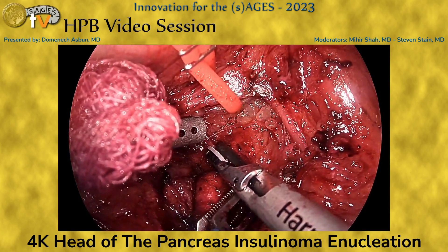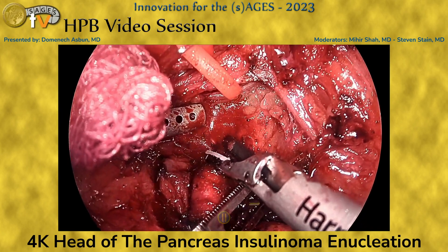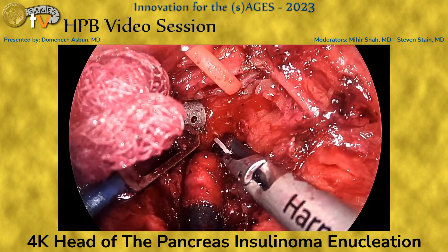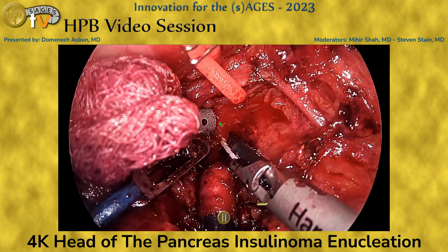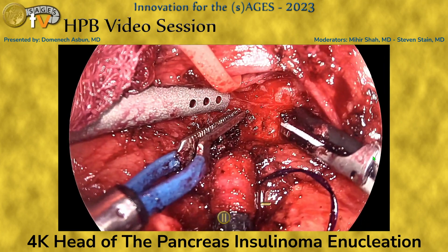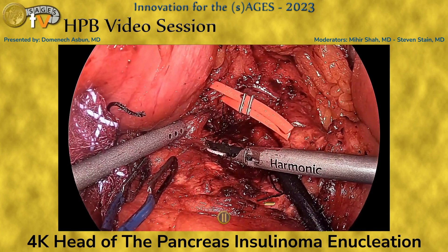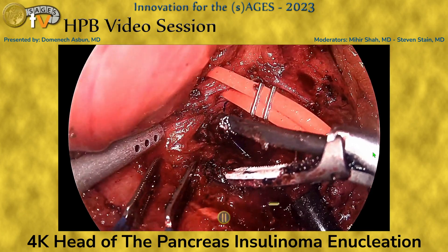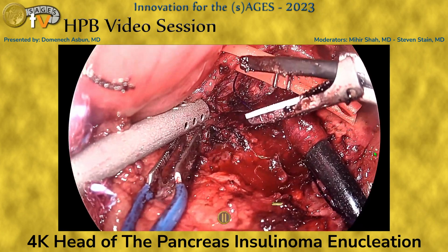We continue with millimetric bites. It's not a large tumor, but it takes a lot of patience to slowly dissect around the lesion for proper enucleation. I want you to pay attention to how the assistant is using the suction device — lots of short bursts of suction. Adequate assistance in these cases is paramount. We use the suction device for retraction and for short bursts of suction as needed, and it's very important for the assistant to understand how to best use it.